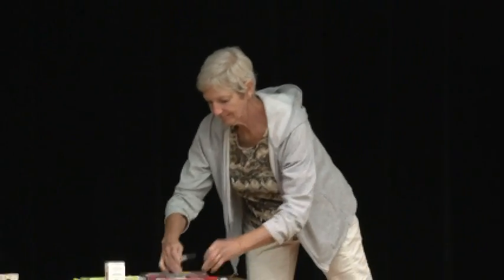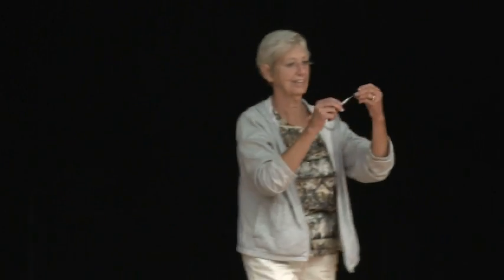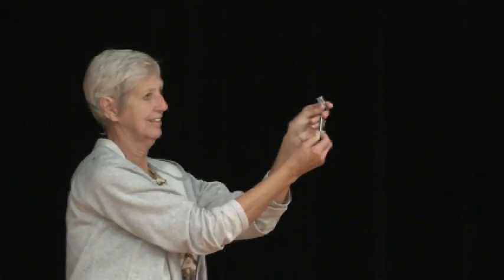So what you're going to do is take the cap off the vial of powder. You're going to take the cap off the needle. You're going to put the needle into the vial of powder, and you're going to push the whole cc of saline into that vial. And that white powder is like cotton candy. It's going to quickly turn into a clear liquid. You just need to give it a little shake, keep it together as a unit, give it a little swirl, and that'll help mix it up.